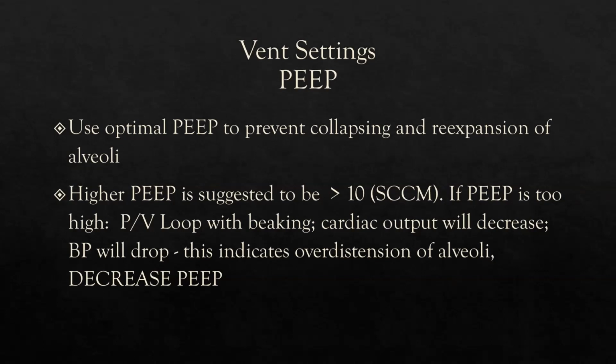And what about having too much PEEP? What started happening? The blood pressure dropped. And do you remember? That was different than optimal PEEP.